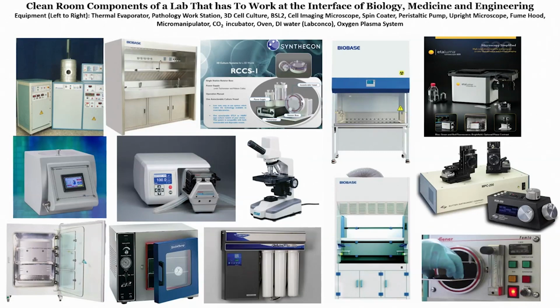So that kind of clean room where a person can work at the interface of biology, medicine, and engineering, you will see a thermal evaporator, you can see a pathology workstation, there will be a 3D cell culture, a biosafety hood, right.